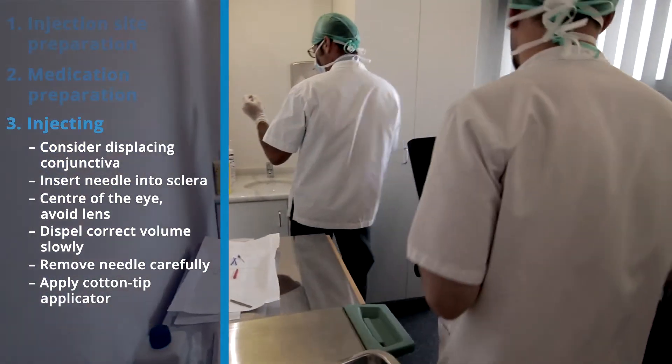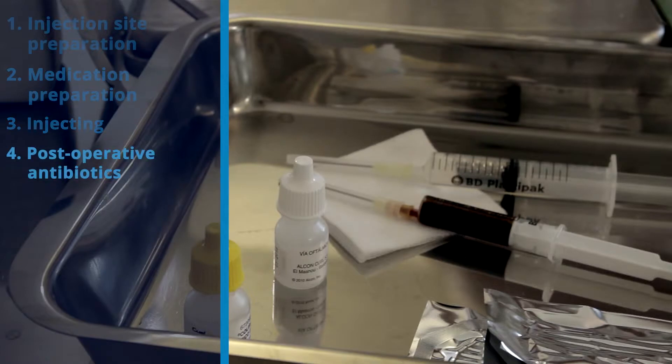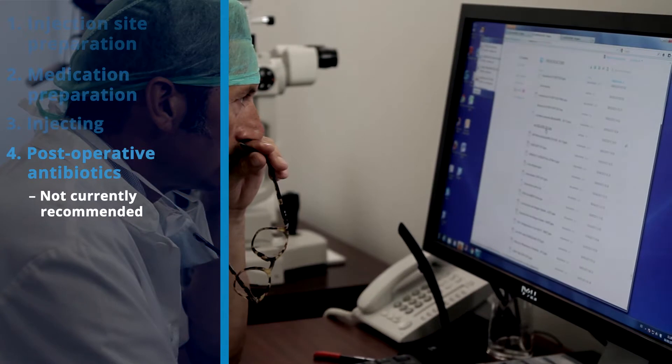The needle and syringe are then discarded in accordance with local regulations. Post-operative antibiotics are not currently recommended, unless local hospital regulations dictate otherwise.